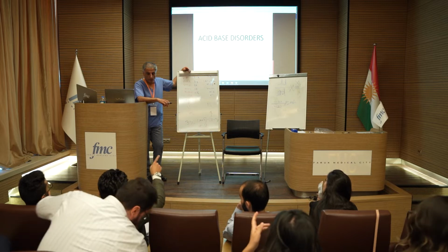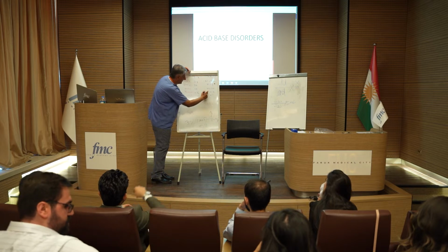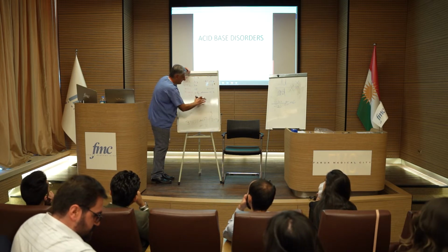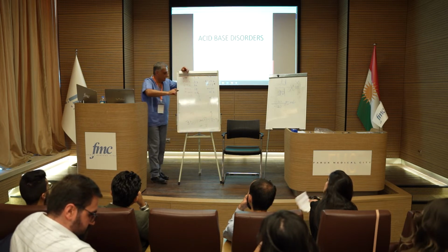This is the range on the other column, right? Minus lactate, yes, is less than this one. This one and this one. Yeah, less than 1. Lactate less than 1, and the base is plus minus 2.